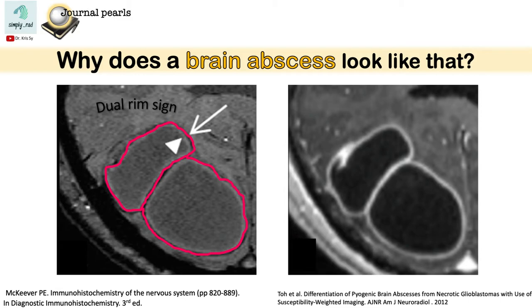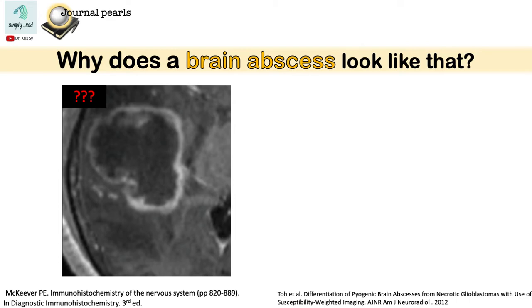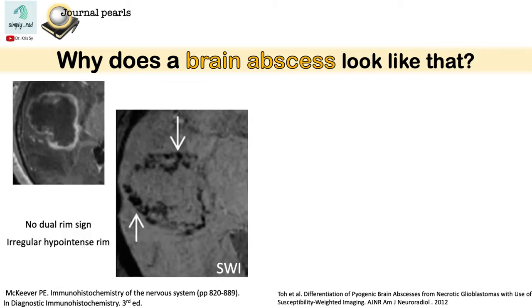So why is this dual rim sign useful? If you look at a rim-enhancing lesion, you might include an abscess as part of your differential diagnosis. Aside from the DWI and the appearance of the margin on the contrast study, we also look for other findings to support our differential diagnosis of abscess. So let us look at the SWI. On SWI, the hypo-intense rim is very irregular as compared to the smooth and complete hypo-intense rim of an abscess.